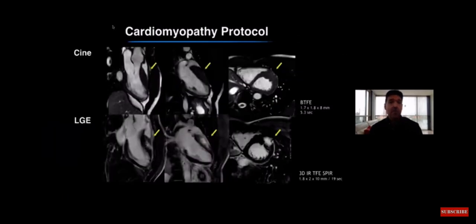Of course, we also study cardiomyopathies by CMR, and this is a case of a 23-year-old young man with basal ECG abnormalities submitted to further study by MRI. Standard cardiomyopathy protocols include cardiac structure, of course, and function, inversion recovery LGE sequences, and mappings. And look at the cine. Note the asymmetrical anterior hypertrophic myocardium with normal LV function and no LV outflow tract obstruction. And in the LGE images, it is easy to see a huge compact gadolinium focus matching the segment with the greatest hypertrophy. So this is fibrotic tissue and of course has prognostic implications.